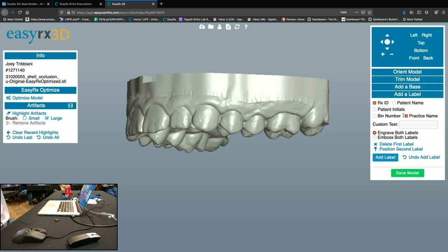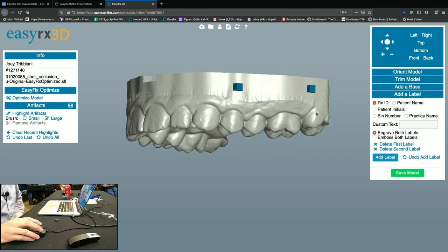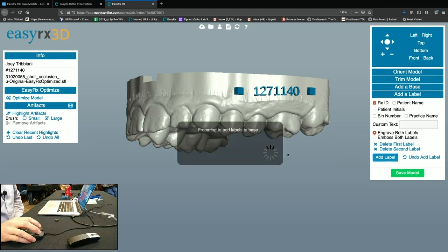RXID practice name will be super long. So I'm going to uncheck this. Position second label, just reading left to right. And this thing will fit on the teeth. You can move it around wherever you want. I always like it up in the base area. And then add label. So then it helps, while you wait, you can read preparing to add the base, carving label in the model, and it's going to do that twice.